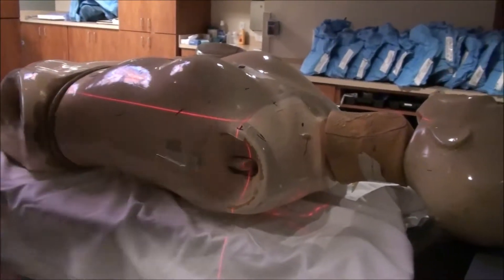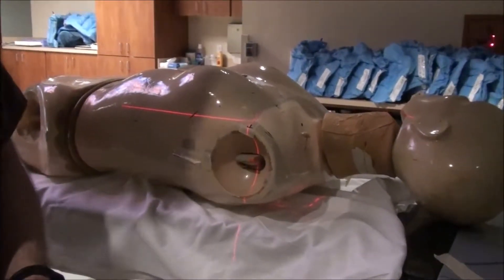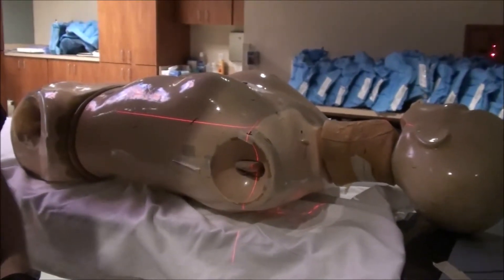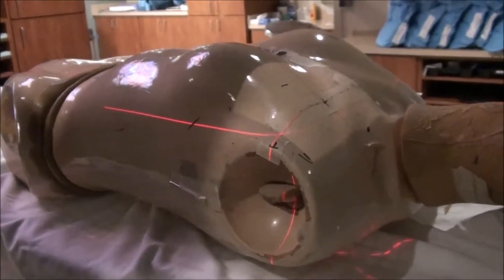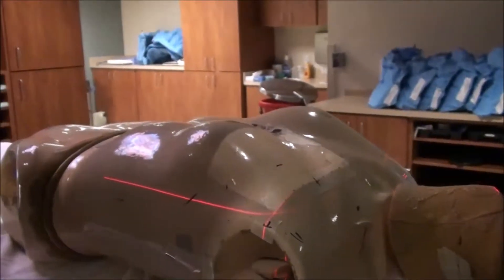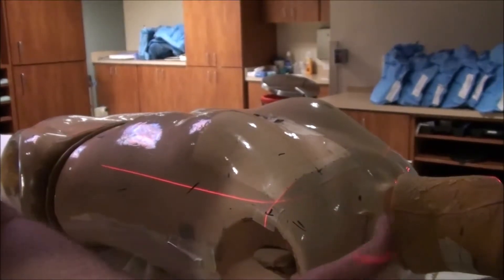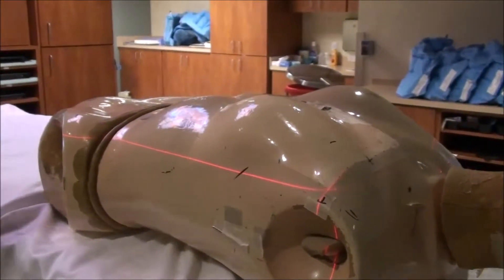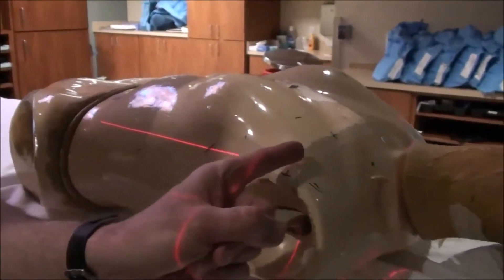Mono-isocentric makes it really easy. All we have to do next is open Y1 and close Y2 once we have this AP supraclavicular simulated. All of the simulation protocols are in place for this. So once you've got that simulated, all you do is open the inferior aspect of the beam — Y1 now opens, Y2 closes.